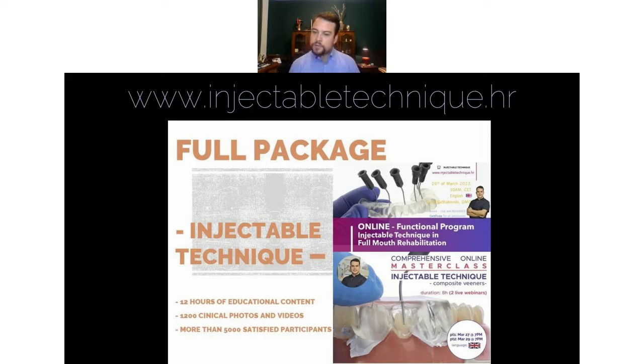Ismail, how to remove bubbles when you discover them before light curing? You just inject more, you wait for the bubble to come up, and the problem is solved. As simple as that. Back in the days, I got a lot of bubbles in like 50% of the veneers. Nowadays, I get it in maybe 1 out of 50, 1 out of 100 veneers.